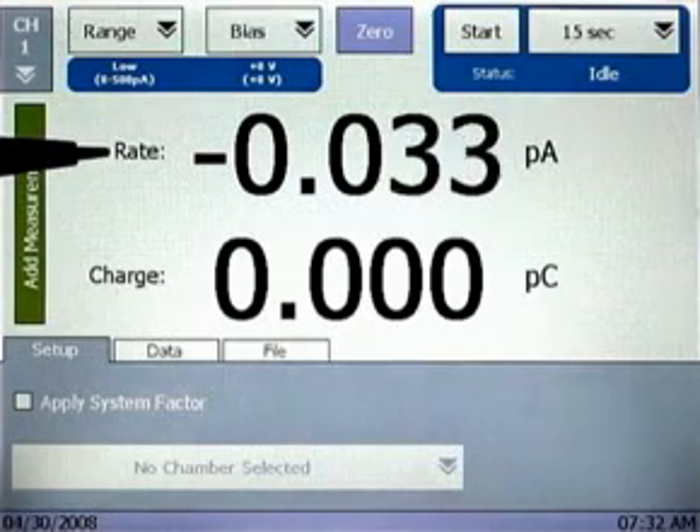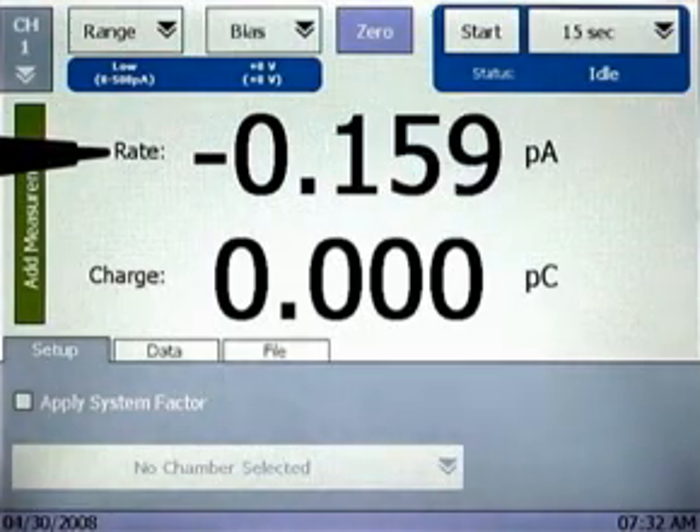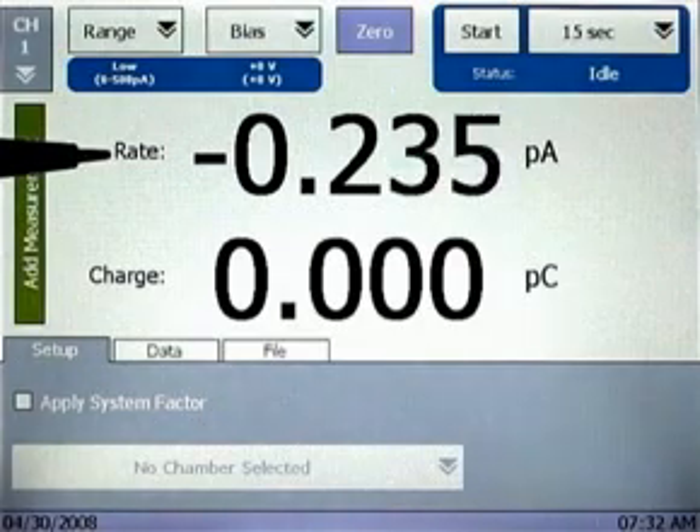As a standard practice, a system zero should be performed the first time the range is modified and then as needed. This is accomplished by tapping the zero button.